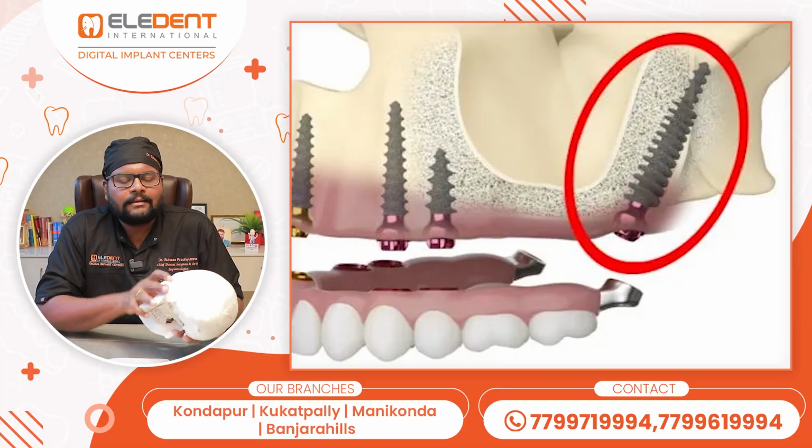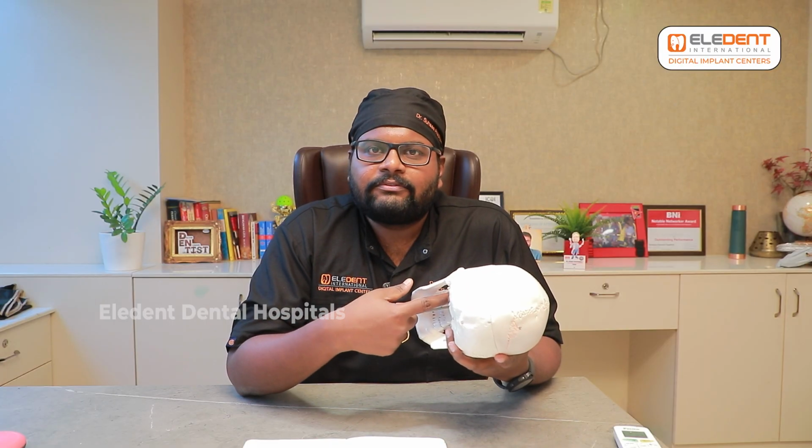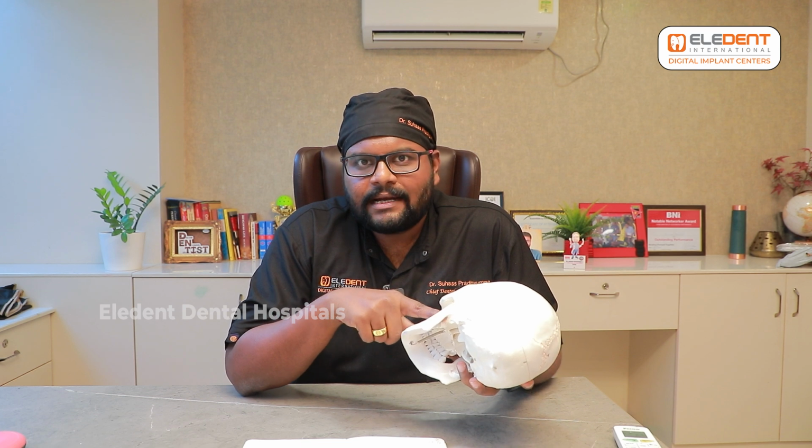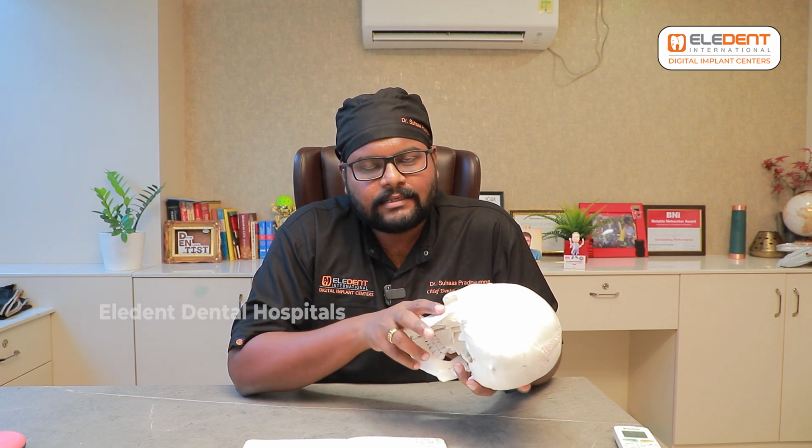Fourth, the pterygoid implant. Similar to zygomatic implant, we have pterygoid plates behind your last most teeth. So a long implant is placed in this region. That is the pterygoid implant.